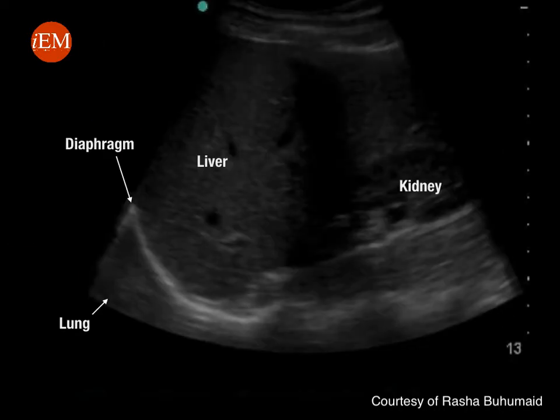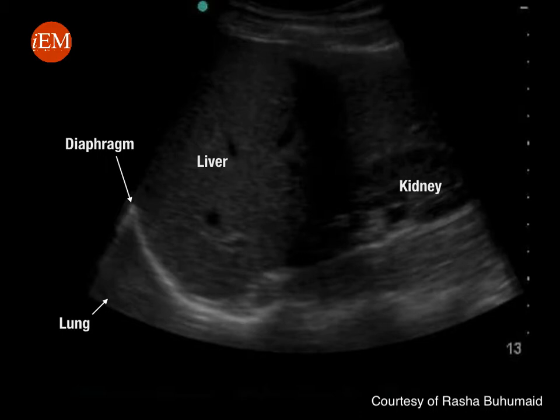This is another example of how a normal lung will appear, looking very similar to the liver. This rules out pleural effusion in the right pleural cavity.